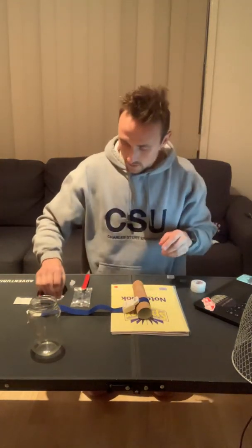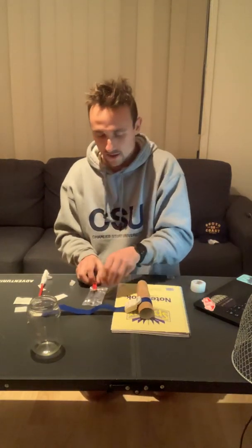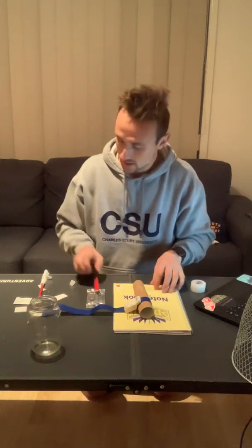So we're going to use the alcohol swabs in a circular motion, from a small circle working bigger. And if I look at the swab and it's dirty, I'm then going to flip the swab and use the other side, repeating the same motion. I'm going to have my flush ready. So the flush is drawn up with saline. It's set aside somewhere clear for when I do flush the cannula.